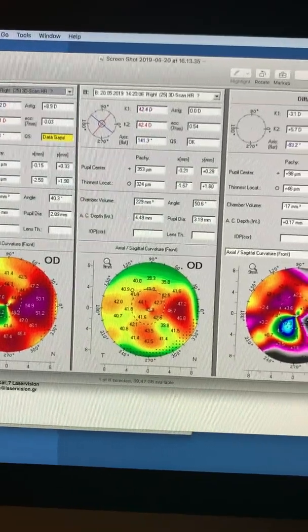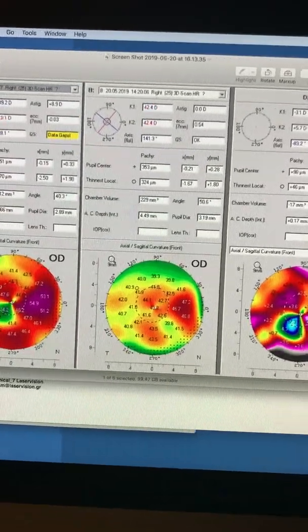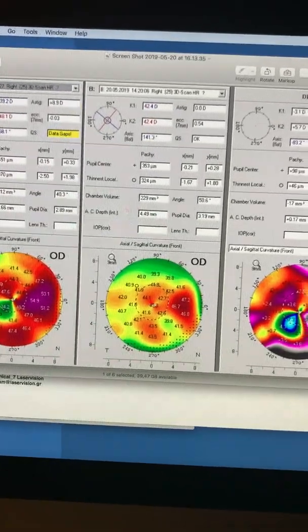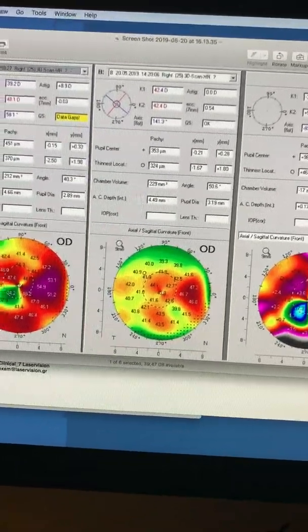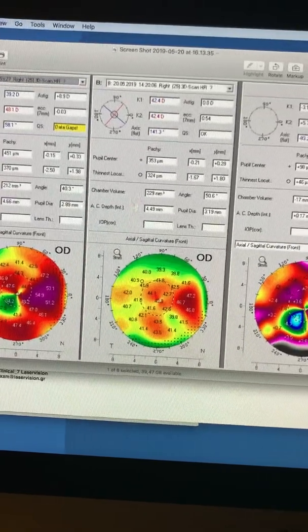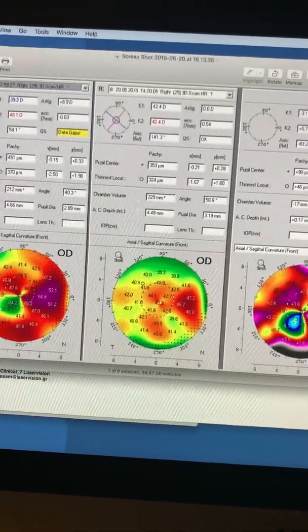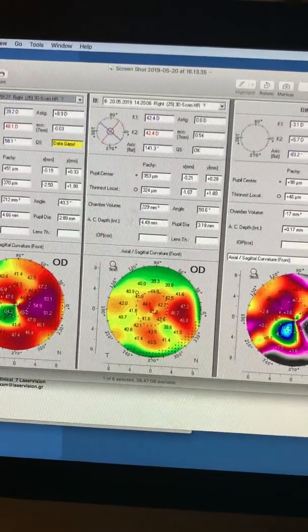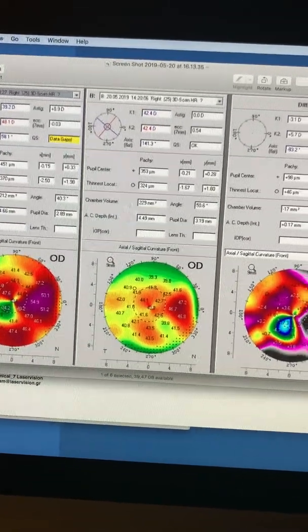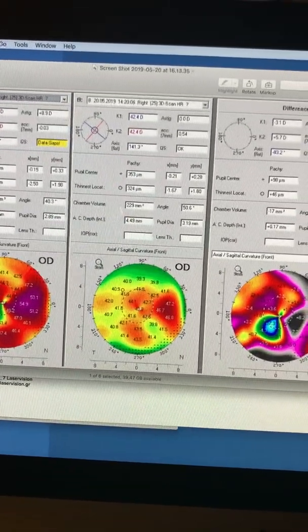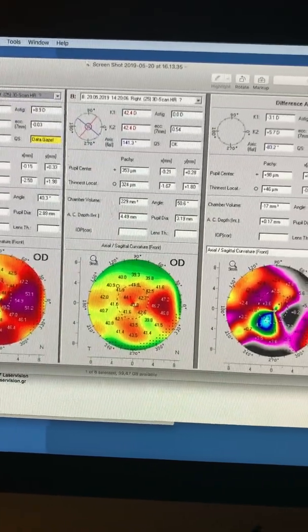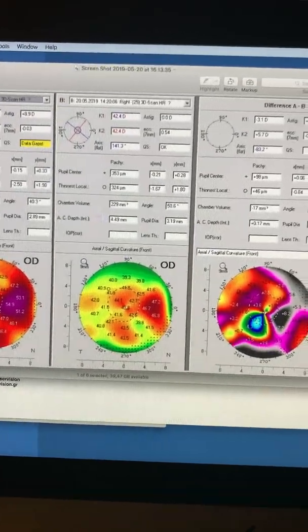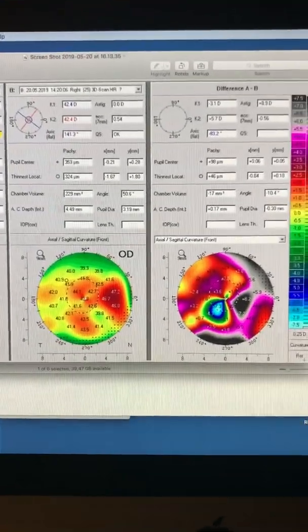A second PTK, five millimeters, 10 microns. A third PTK, five millimeters, 10 microns. And then WaveLight optimized, plus half, minus six at 51 degrees. This was the topo-guided axis of cylinder.